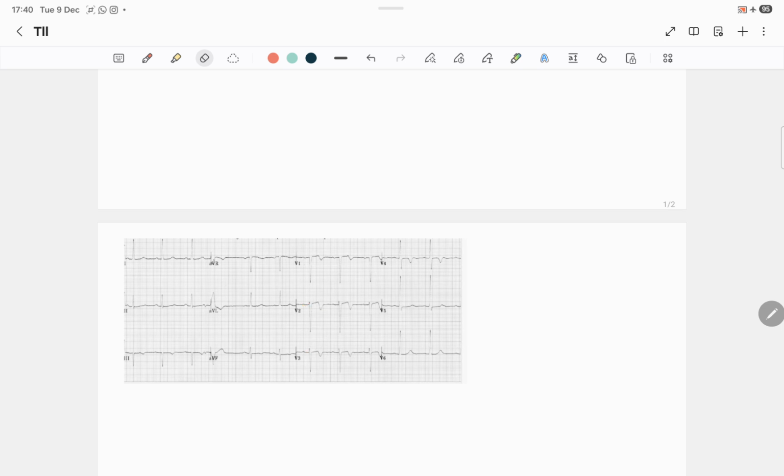There was that pressure, saying, why are you keeping this lady here? There's no chest pain today. Worst case scenario, refer her to the rapid chest pain clinic. They will see her within 2 weeks. But I'd seen this pattern before. So let's talk about why we are worried.